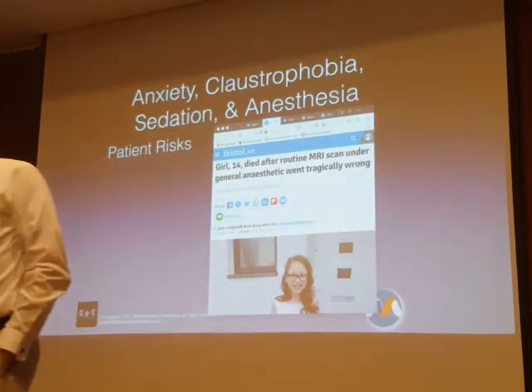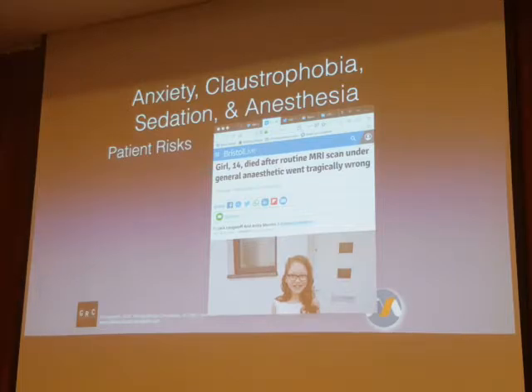From the news accounts, it doesn't appear that the anesthesia machine was not MR conditional and that was what caused the problem. That doesn't appear to be it.